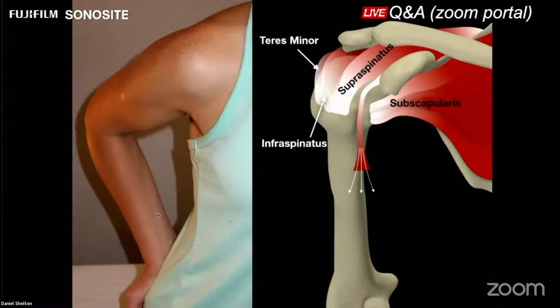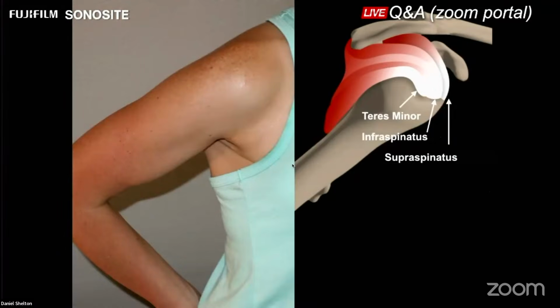And we just tell people to either place their palm in their back pocket. The real key here is to not let there be much of a gap between the elbow and the rib cage. So what we're doing is a couple of things, and we'll do this in the live demonstration. We've taken the greater tuberosity from a lateral superficial structure to this anterior and deeper structure. And we did that by internally rotating, then dragging the elbow back posteriorly, which is not super evident here. So when we rotate the model, both the anatomical model and the photograph, we see how far back this elbow goes.